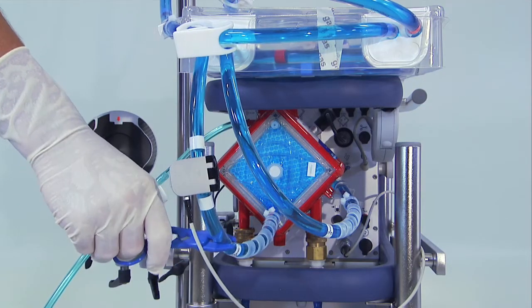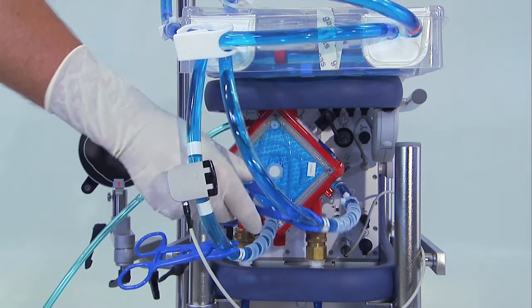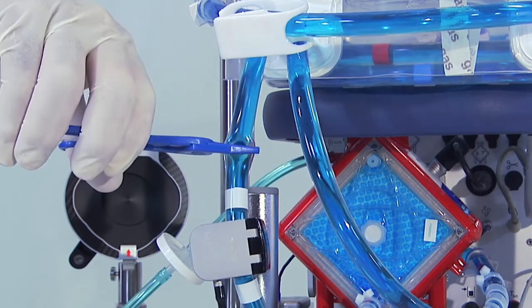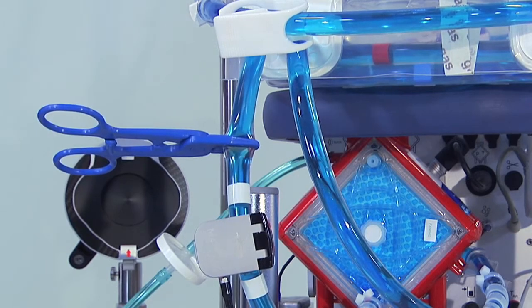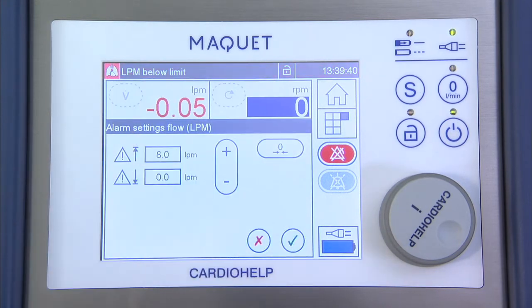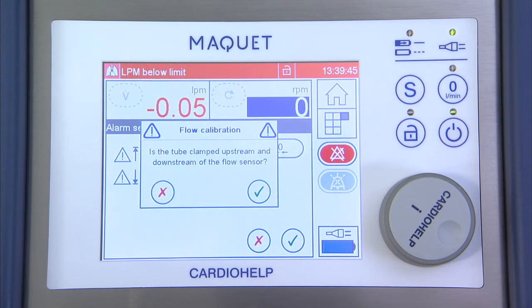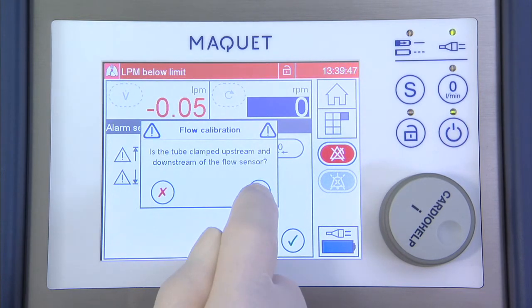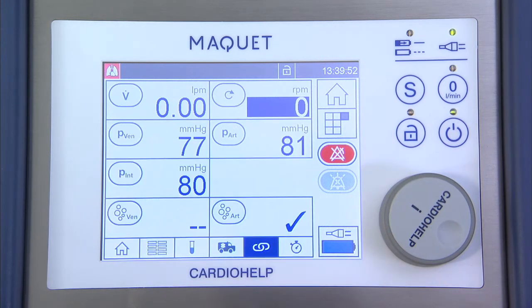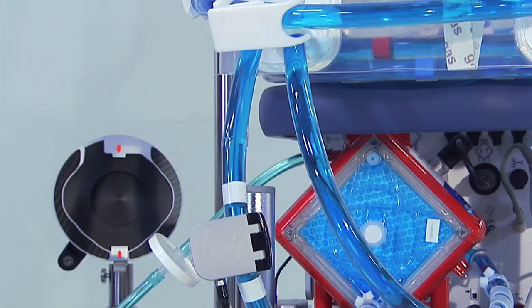Clamp the red line at the blood outlet near the symbol and the blue line at the blood inlet near the symbol. Clamp the red line behind the flow bubble sensor. Calibrate the flow bubble sensor by setting it to zero LPM in the cardio help software. Remove the clamp behind the flow bubble sensor.